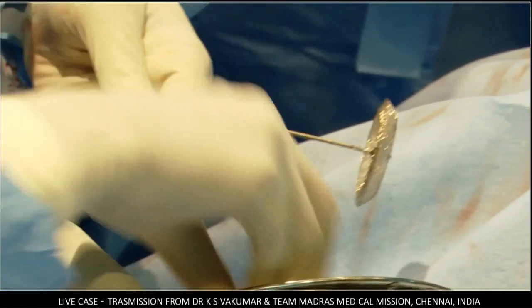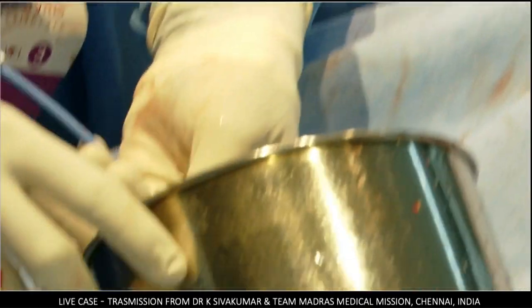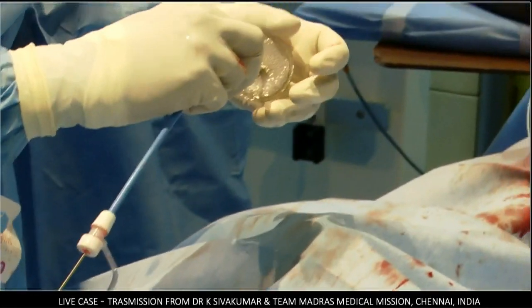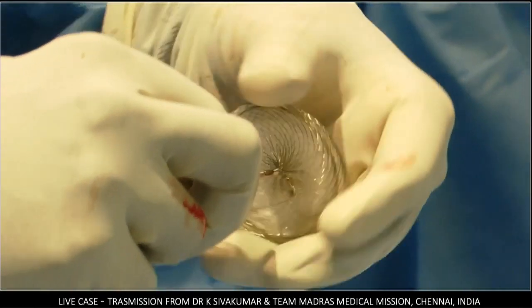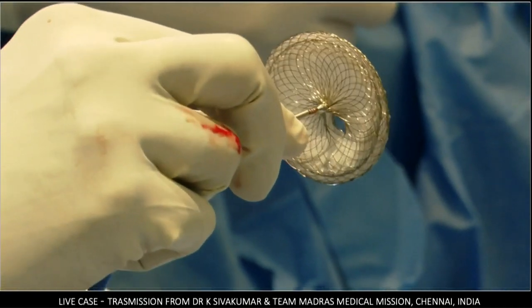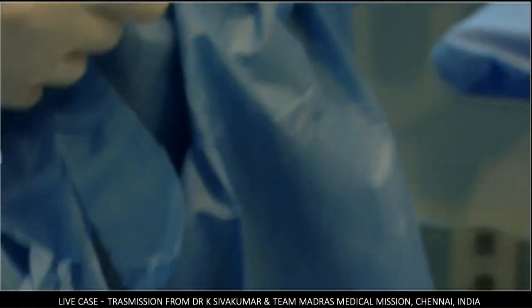We use this a lot in restrictive LV physiology as well as in pulmonary hypertension on the treat and close strategy. So as I show you, that is the fenestration. It's showing up nicely on the camera. I'm able to see that.